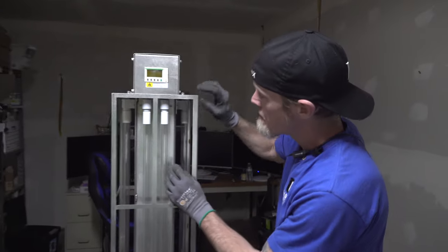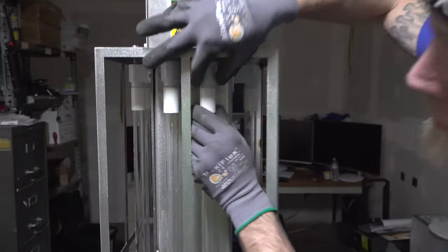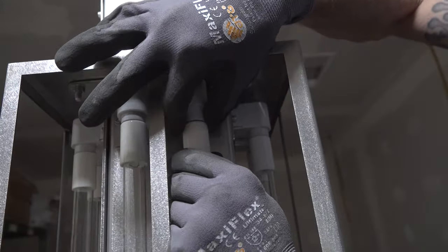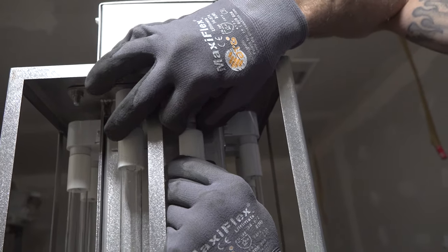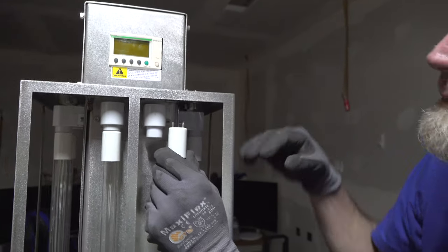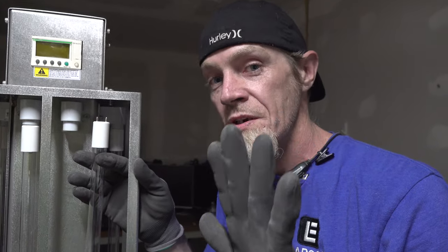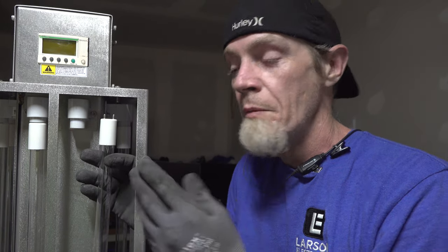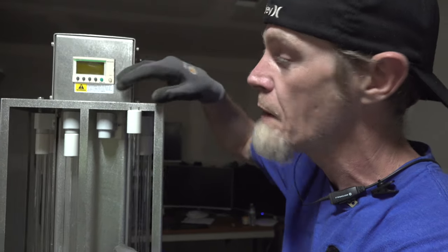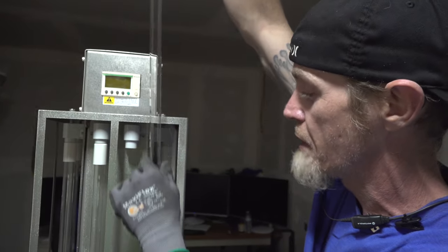To exchange the bulbs, you simply press down on the bulb while depressing the top tombstone and slightly pull the bulb forward. You want to ensure that you always wear hand protection when handling these bulbs, because the oils from your hands will damage the lamp and compromise the longevity and integrity of it as well.